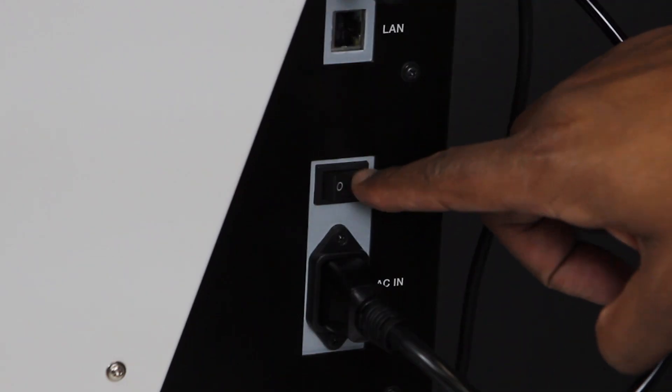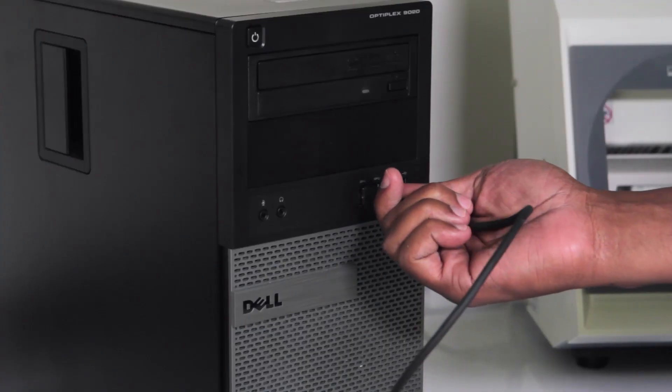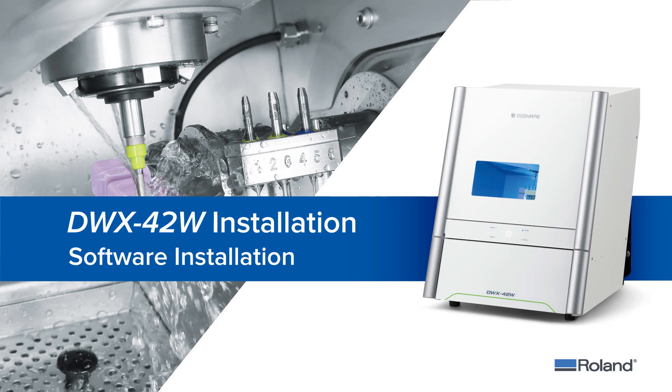Turn your DWX power to ON and connect the USB cable from the mill to your computer.